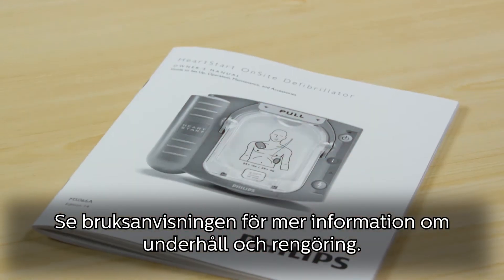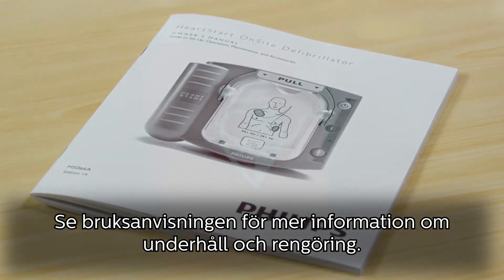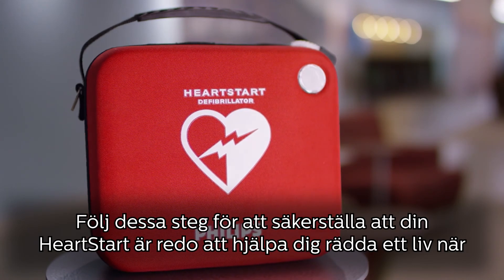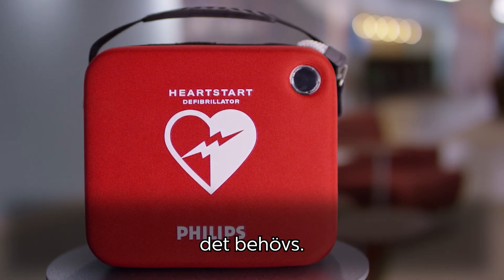For more information about maintenance and cleaning, check your Owner's Manual. Follow these few steps and you will ensure your HeartStart is ready to help save a life when you need it.